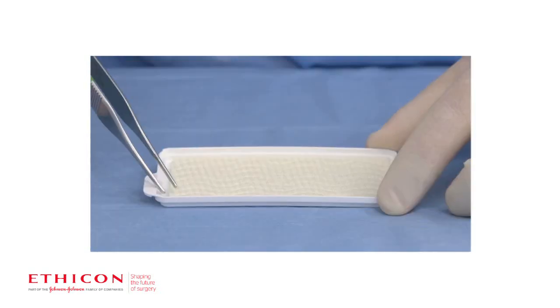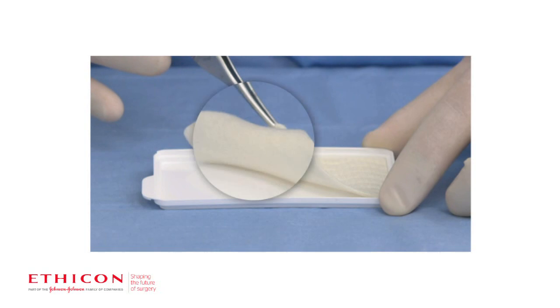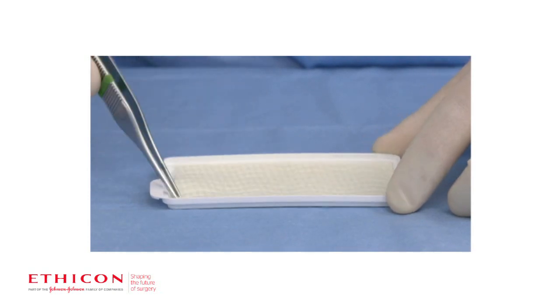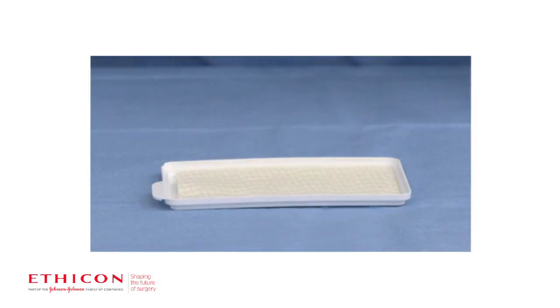The lower portion of the tray contains Everest with the active side facing downwards. The active side is powdery in appearance. The non-active side has an embossed wave pattern. Keep Everest dry after opening. The patch can remain in the sterile field for use throughout the procedure.